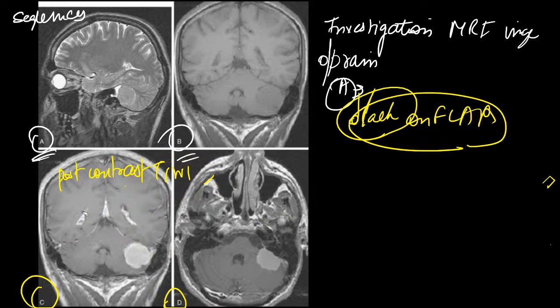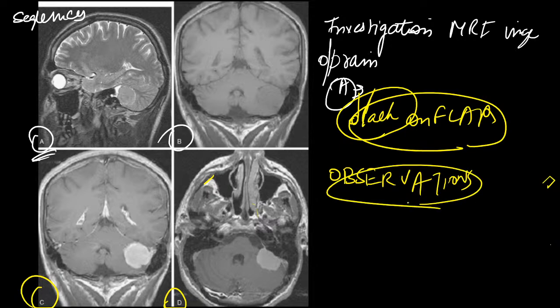Now, guys, tell me what are your observations in this case. Anyone? Come on guys, can you see any abnormal thing? Can you find any abnormality within this MRI image? Any abnormality? Cerebellum infarct. Why do you say there is a cerebellum infarct? How will an infarct look?